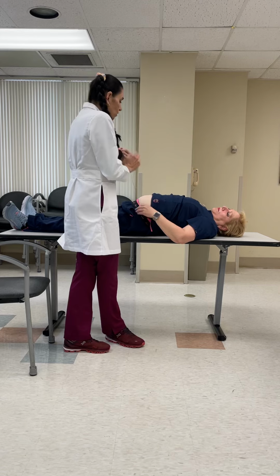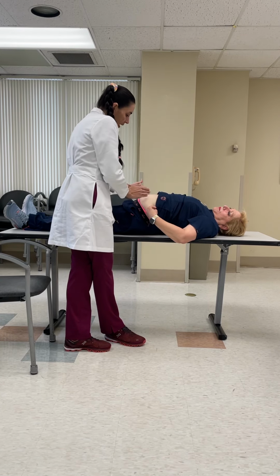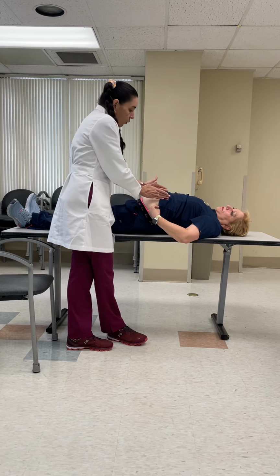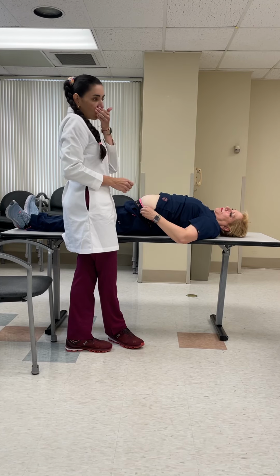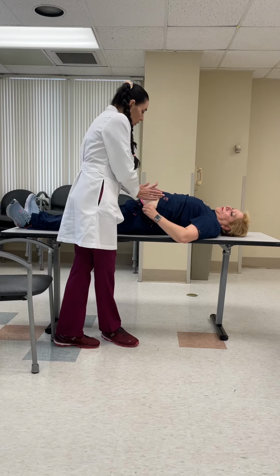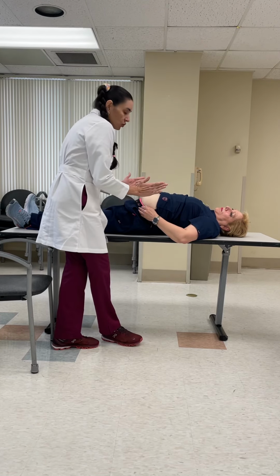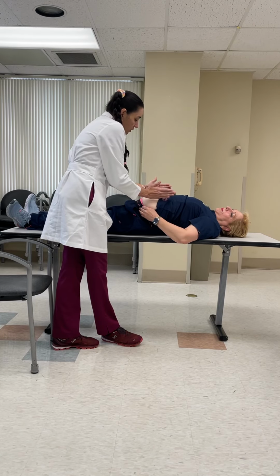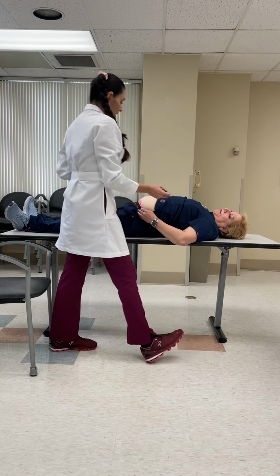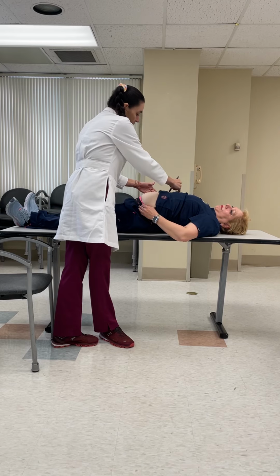We have to ask the patient to tense the muscle so we can really see what the limits are, because the stoma has to be within the limits of the rectus muscle. The other way you can do it is to tell the patient, close your mouth and cough. Or if the patient is not able to do it, you can tell the patient to bend their head down, and when they contract, you're going to see the rectus muscles, and you can set up the limits with the pen.